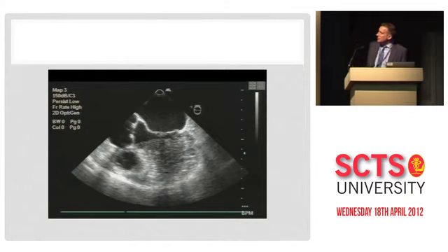So there's the left atrium, nothing much in evidence, so I think if we turn the probe round a bit, like we're used to doing, and pull the probe out a little bit, there we can see it, a rather horrible looking beast. And myxomas always do look rather sinister and nasty, although thankfully benign. So again, that's the same tumour. You can see the septal attachment.